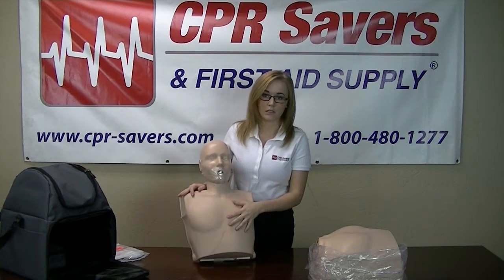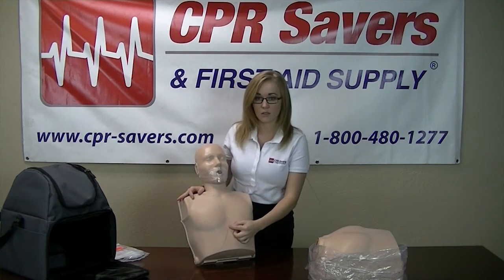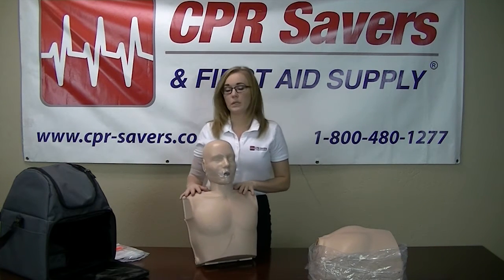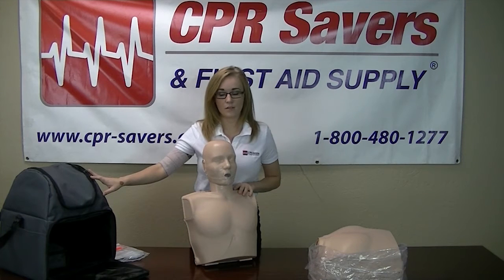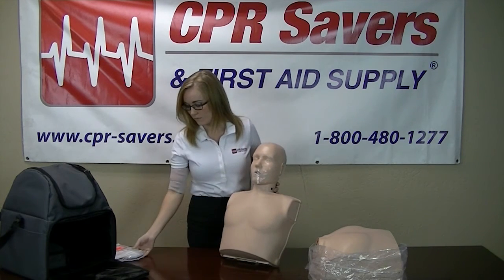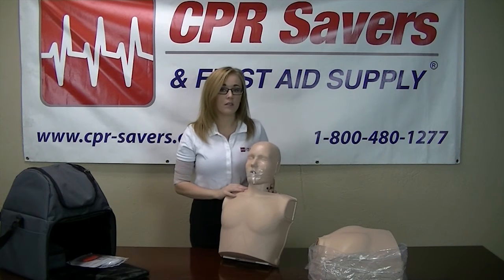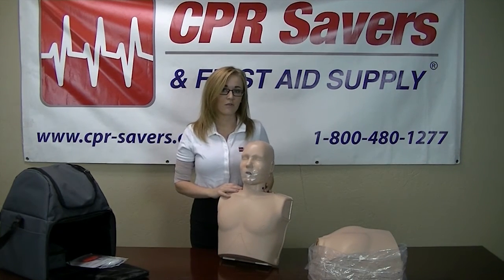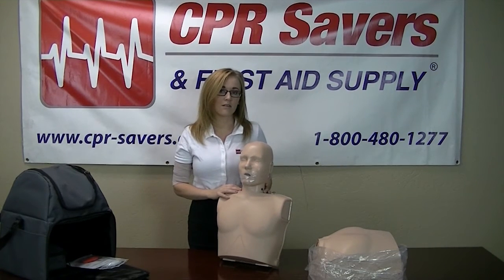Preston mannequins are easy to clean. They're all going to be anatomically correct, with the rib cage and the sternum. The complete case is going to be 13 pounds, including the bag. Stores conveniently and easily. Again, my name is Lainey, here with CPR Savers and First Aid Supply. This is the Preston Ultralight Mannequin.